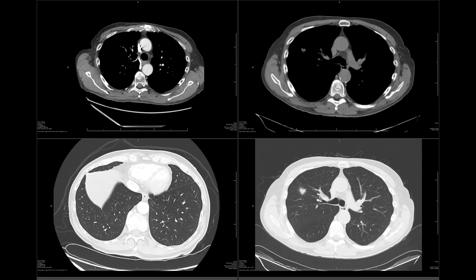Hi everybody, it's Rishi Agarwal. In this video, I'm going to show you the normal post-operative appearance of each lobectomy on CT. Sometimes residents have trouble figuring out which lobe is gone, so I'm going to show you how to figure it out just by looking at the surgical clip line.